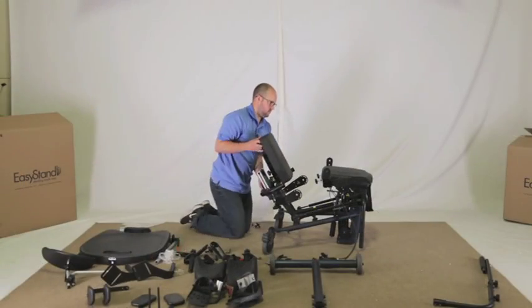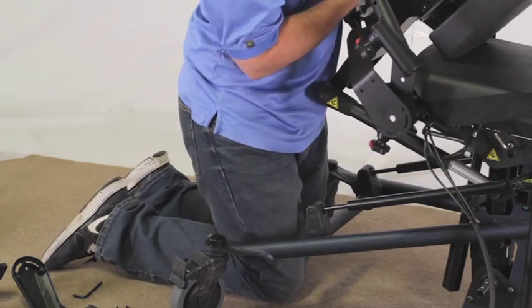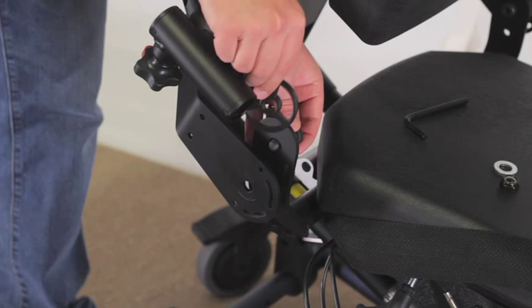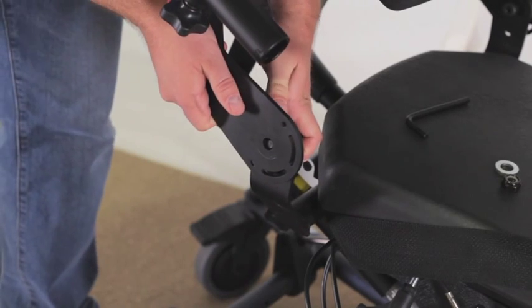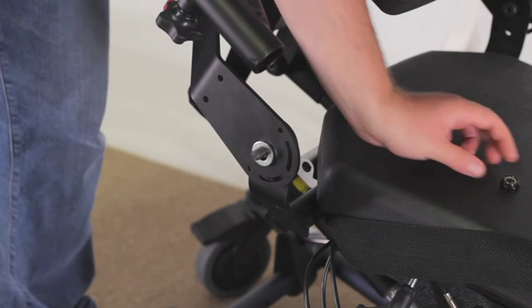Position the back to line up with the hip pivot of the seat. Line up the holes and place the plastic washer between the back and the slot on the seat. Insert the bolt from the inside of the unit — do the same on the other side. Place the metal washer and lock nut onto the bolt.